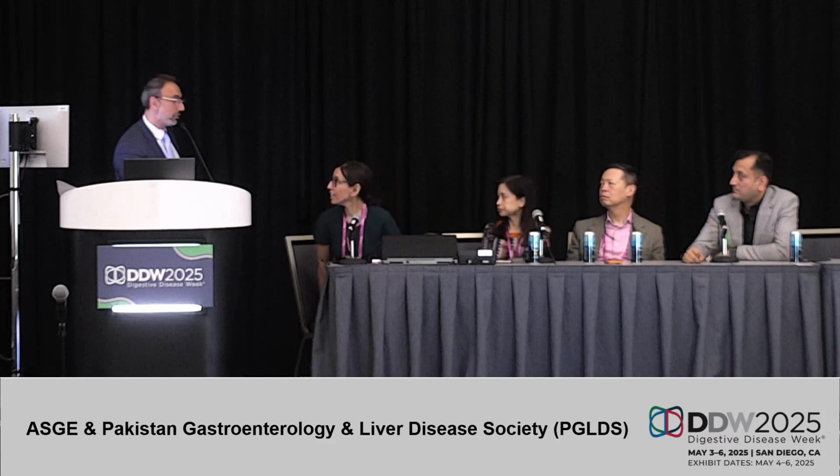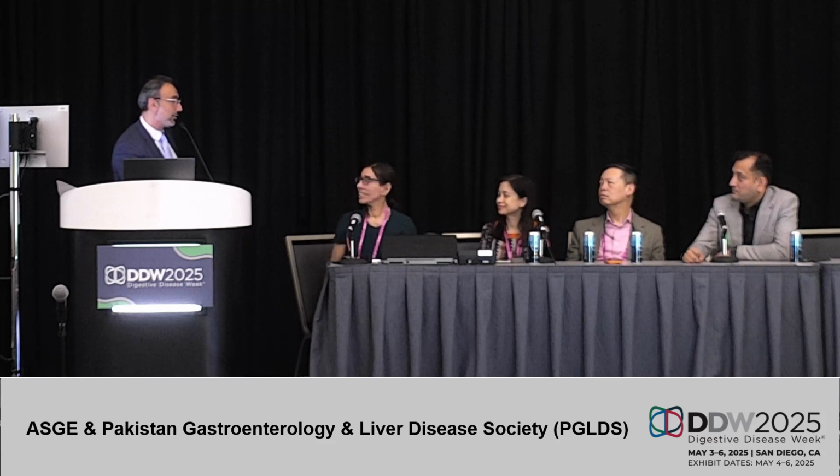With that said, if the patient is 80 and they don't want to do that, and they're concerned, the tumor has grown by half a centimeter this year, then typically they're asking us to do it. Yeah. We've also been doing it for renal metastases, ablation in the pancreas.